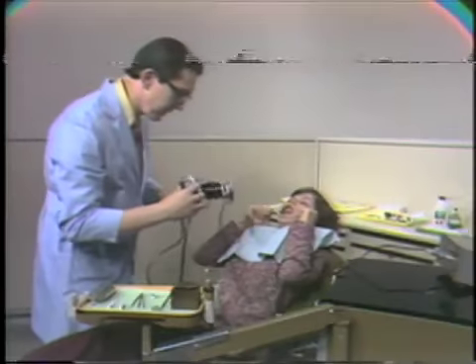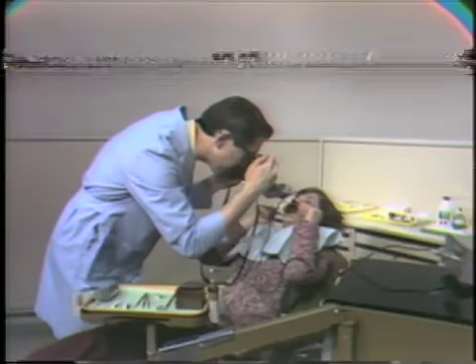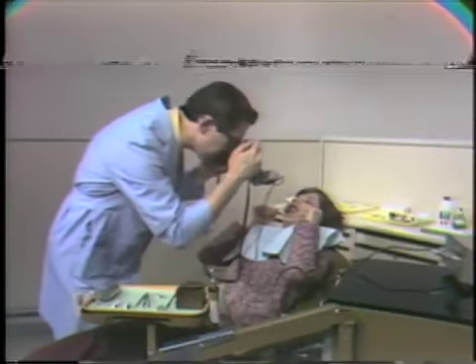Now we're able by photography to register both before and after pictures of our work. Now if you don't have a real good camera that can make registrations like this, then my suggestion is to use something like a good shade guide. But because of the gray color and the variations of color on the teeth, sometimes it's very difficult to use a shade guide.